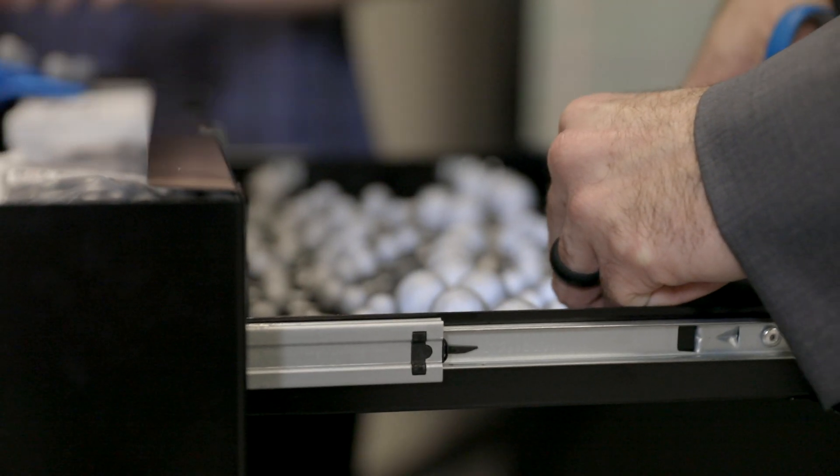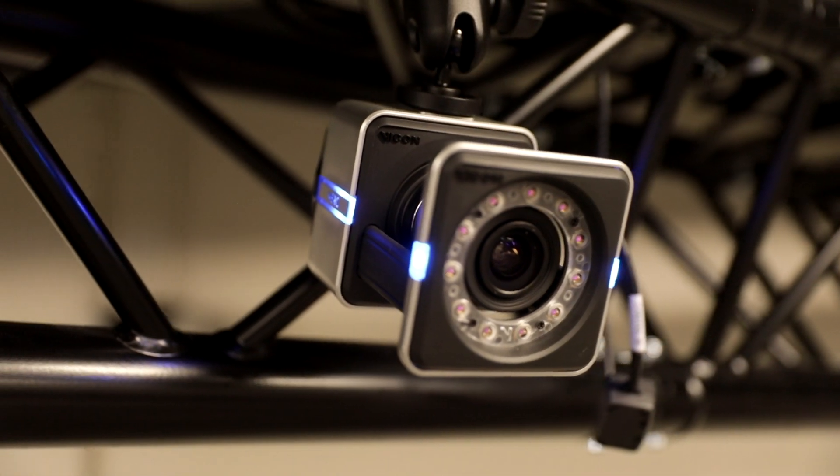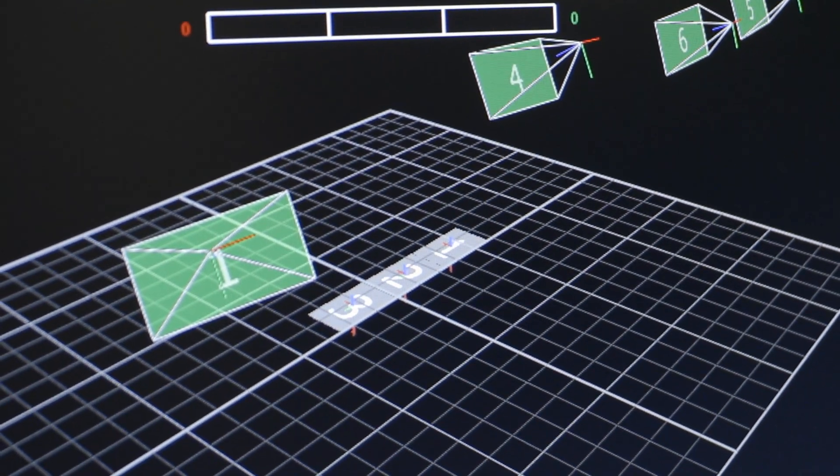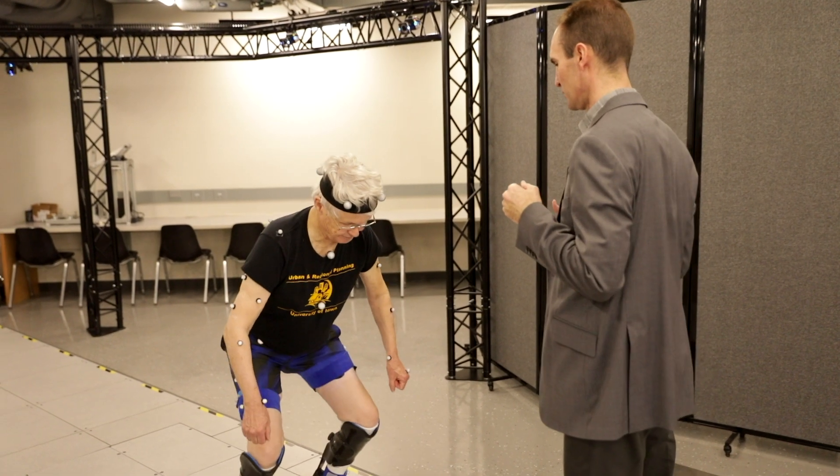These are retroreflective markers. They use a material similar to a running shoe, and so the light reflects from the cameras, reflects off these markers, and then back to the camera. By using a combination of 12 different cameras, we're able to triangulate its position with a precision of about a tenth of a millimeter.